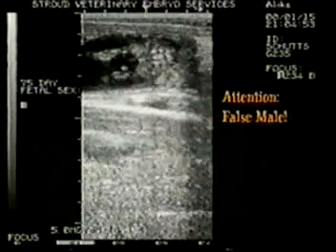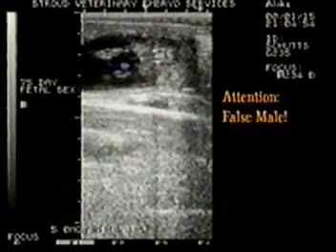When the tail is tucked between the hind legs, its tip can approach the area just caudal to the umbilicus and give the impression of a bi- or trilobed MLGT, as depicted in this footage. The blue highlighted echogenic structure is actually the tip of the tail and not a MLGT.